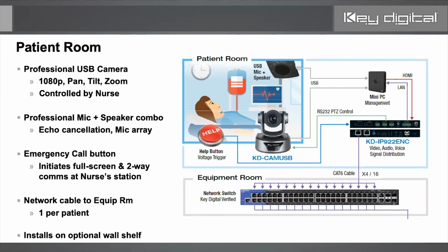So that's why we're sending it into our KD RM PC, the remote management PC, to have that camera feed go out as an HDMI. But also for the audio, how do you have the USB input of the microphone to the PC? How do you have that go out over HDMI, right?